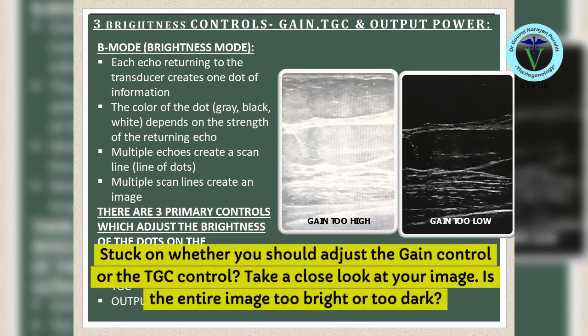Stuck on whether you should adjust the gain control or the TGC control? Take a close look at your image. Is the entire image too bright or too dark?